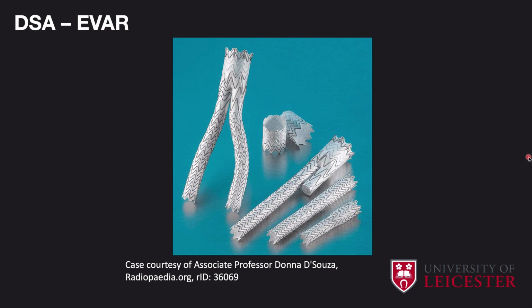These are EVAR stent grafts composed of metal scaffolding and lined with graft material. They are constrained into small tubes that we can deliver into the aorta, and once deployed, they will expand to their initial shape and be held in place within the aorta to exclude blood flow to the aneurysm sac.